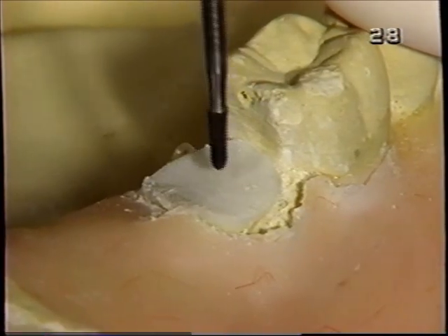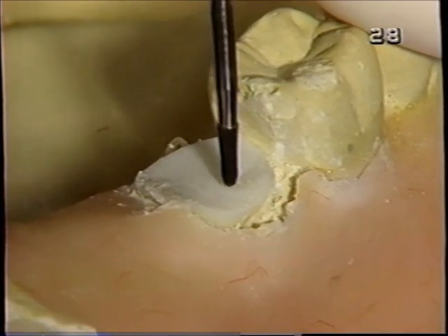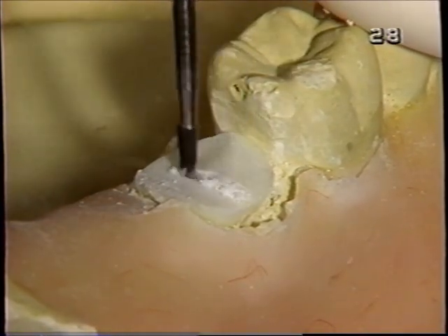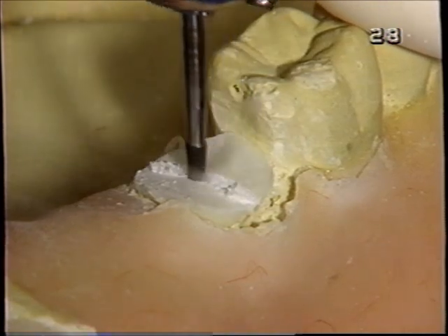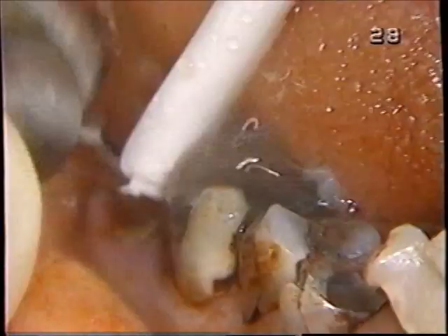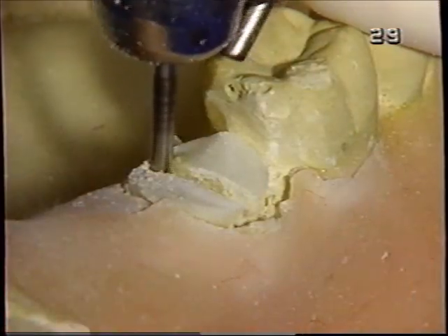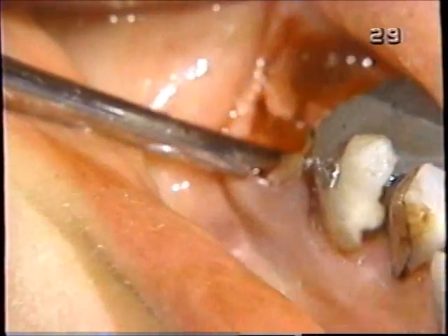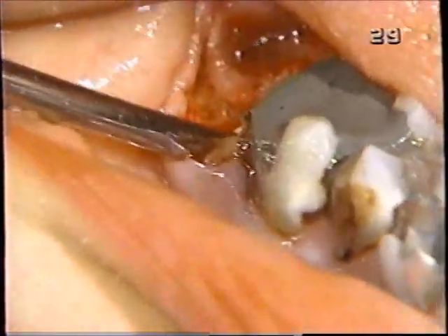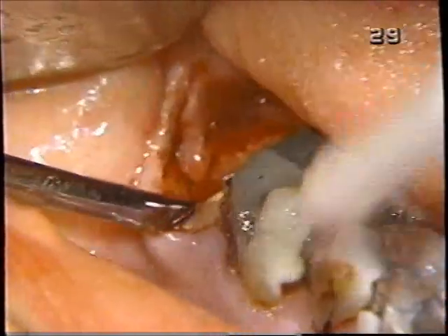We're going to use the Impact Air 45 surgical handpiece, which does not blow air into the surgical field, to separate the roots. Now the 301 is in there. What we're doing is affecting separation of the two roots so that we're dealing with two entities and not one.